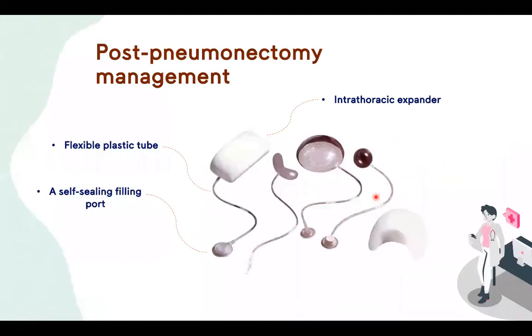So, we can say that it can be managed well by implanting a prosthetic lung inside the pneumonectomy cavity, which will allow correct repositioning of the mediastinal structures and subsequent reduction of pressure on the contralateral bronchus, and achieve good results with lower morbidity and no mortality.